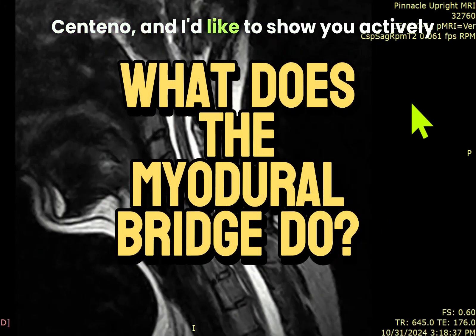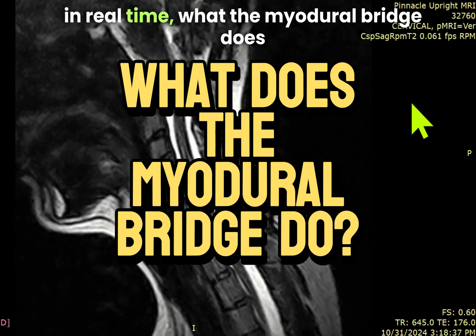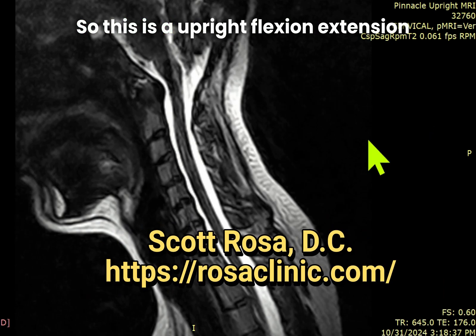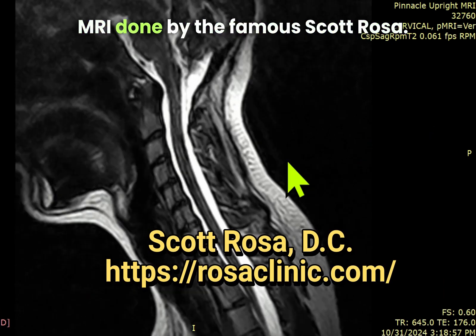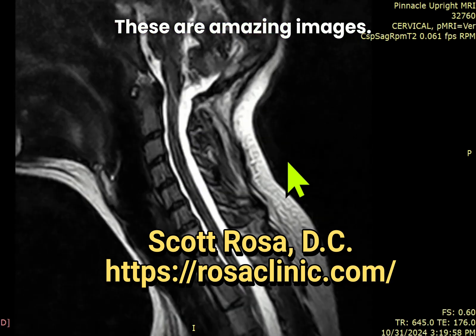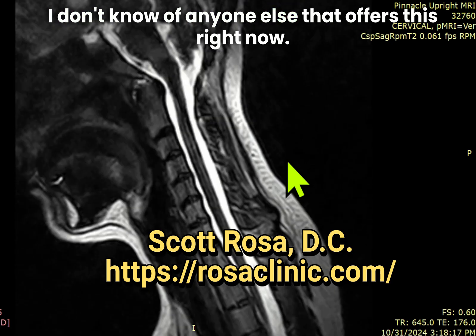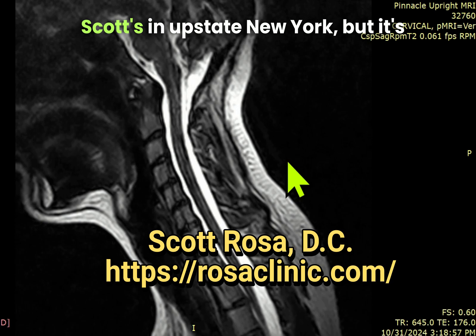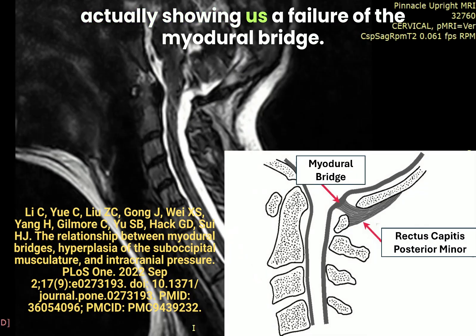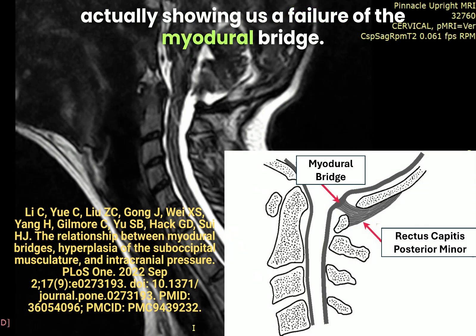Hey, it's Dr. Centeno, and I'd like to show you actively, in real time, what the Myodural Bridge does and why it's a big deal. This is an upright flexion-extension MRI done by the famous Scott Rosa. These are amazing images — I don't know of anyone else that offers this right now. Scott's in upstate New York, and it's actually showing us a failure of the Myodural Bridge.